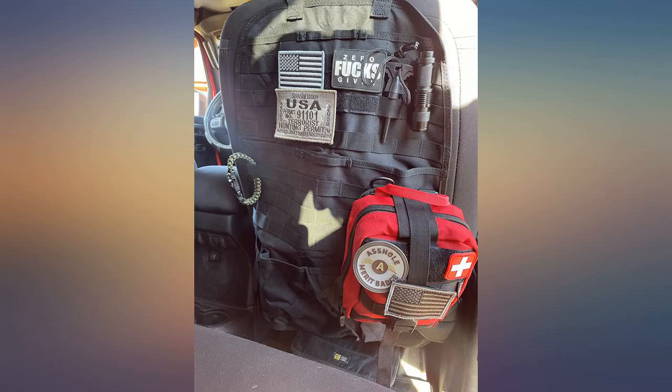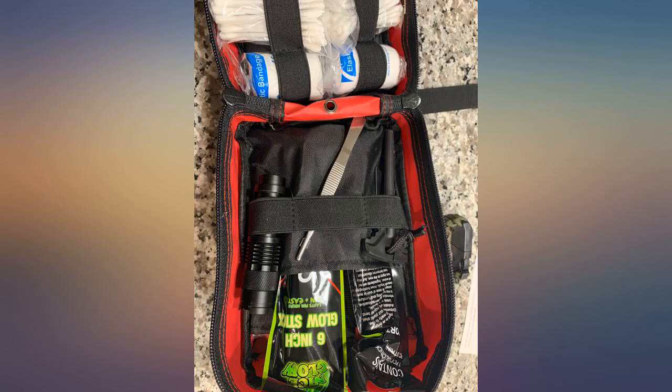The exterior configuration allows you to backpack it, belt carry it, or just have the little packet around because it weighs nothing. Worth every penny.